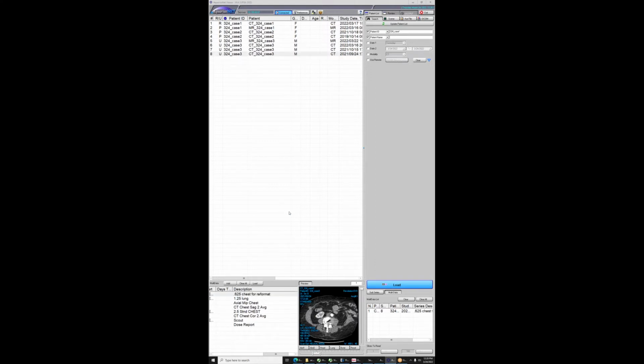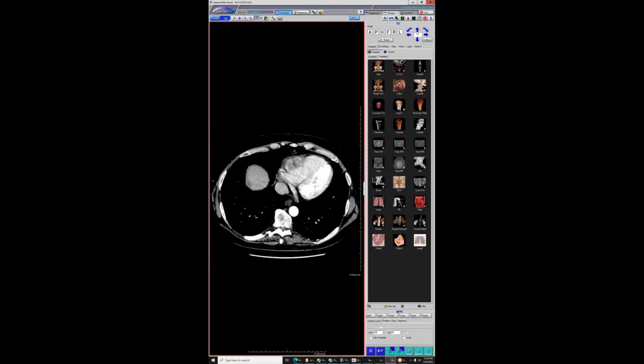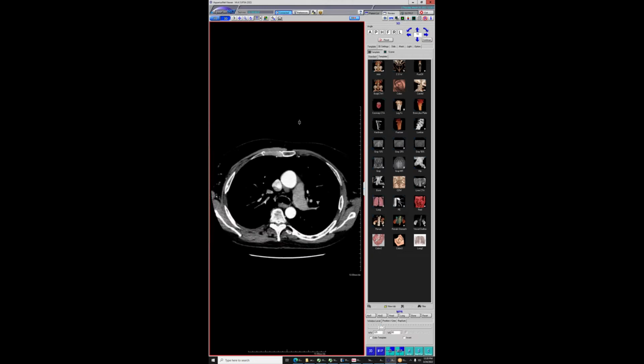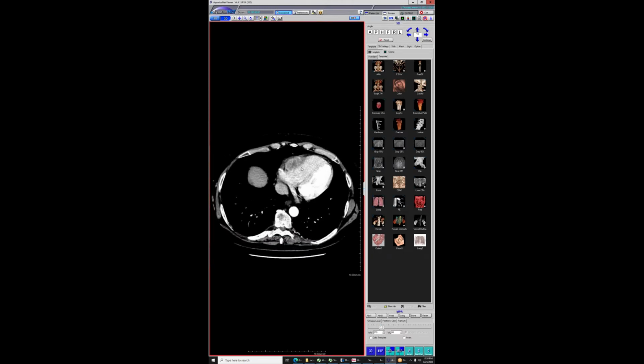And then this is a case where I don't remember what this was for, but this patient came in. He had this lesion here growing for a study or two before this. This was missed, which I can understand, we're reading fast, and there's the lesion here in the RV with some adjacent pericardial fluid.